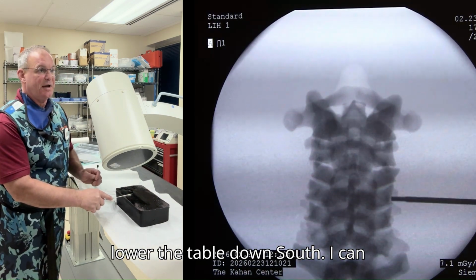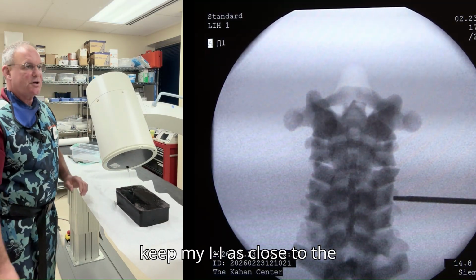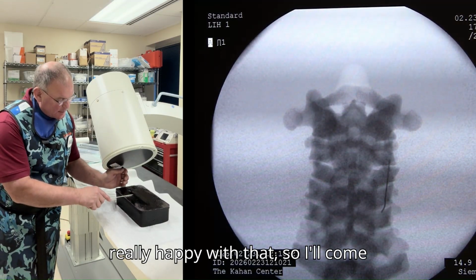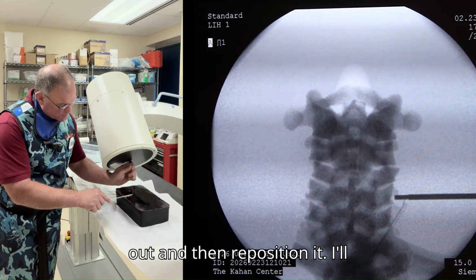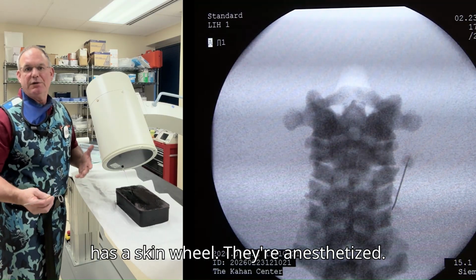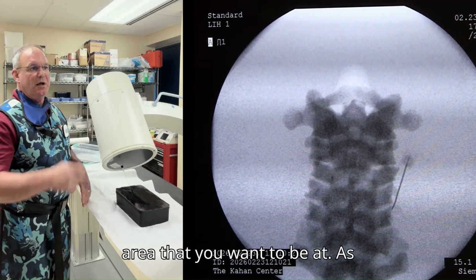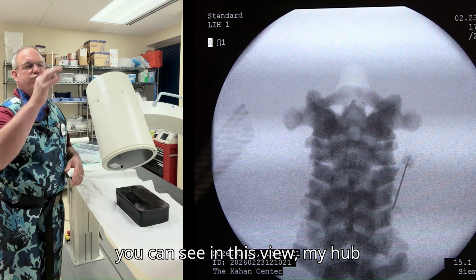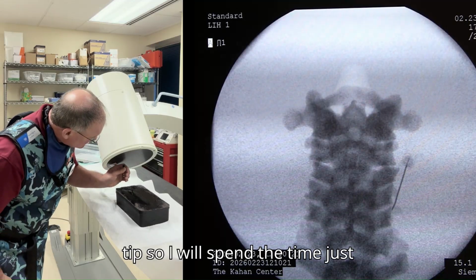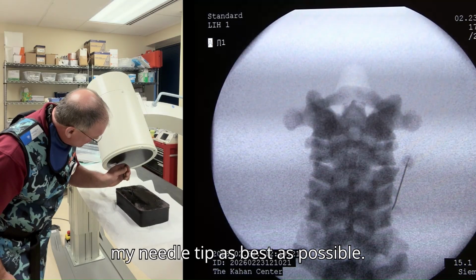My approach tends to be of a craniocaudal approach. I'm going to lower the table down so I can get underneath there. Again, trying to keep my eye as close to the patient as possible. Over here, I'm not really happy with that, so I'll come out and then reposition it, because I can. The patient has a skin wheel. They're anesthetized. Always try to make sure you're over the area that you want to be at. As you can see in this view, my hub is way cephalad compared to my needle tip. So I will spend the time just at the skin to get my hub over my needle tip as best as possible.